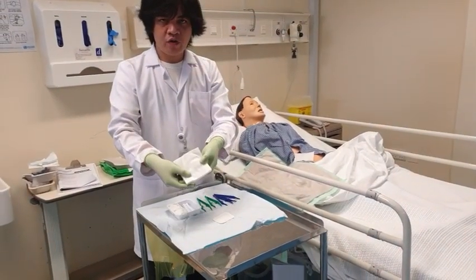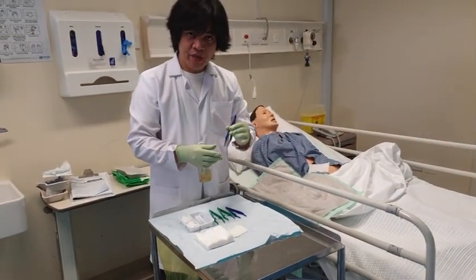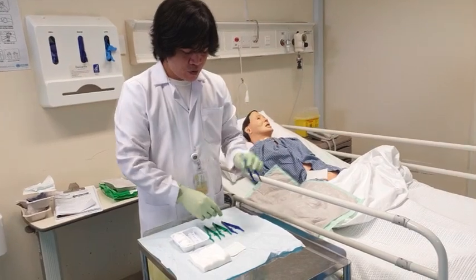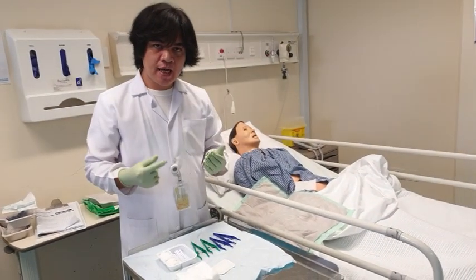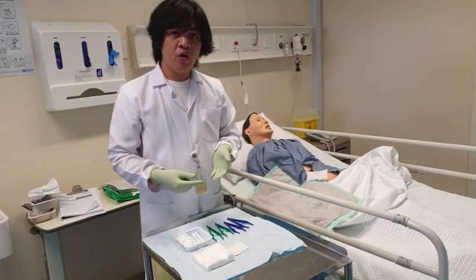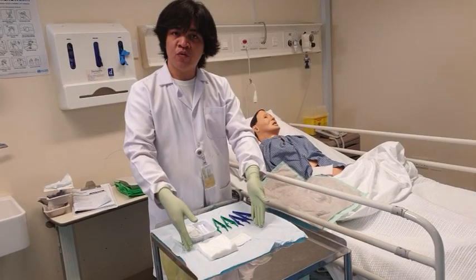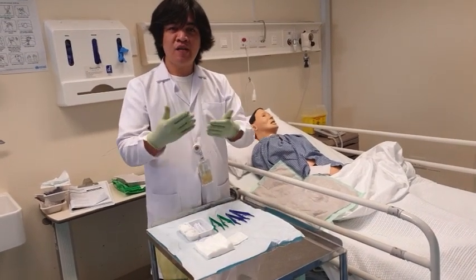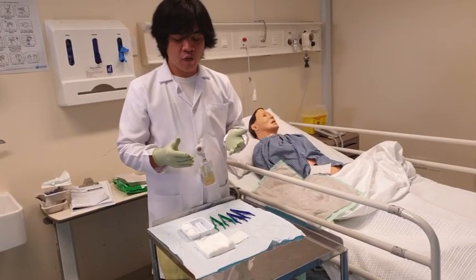We have the 4x4 gauze to dry the wound. We also have forceps. We call this one forceps. We have the blue forceps and we have the green forceps. We need to decide which color of the forceps we're going to use with the patient and which color of the forceps we're going to use with our table. We do not mix those forceps or else we're going to cause infection to our patient.